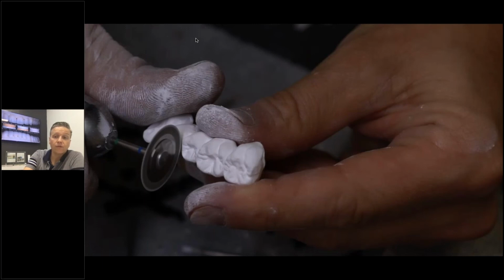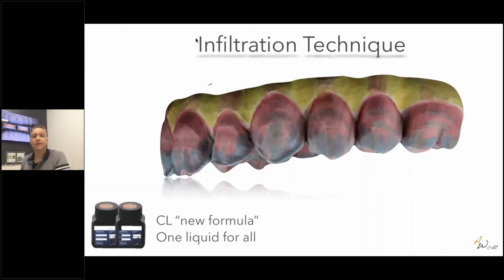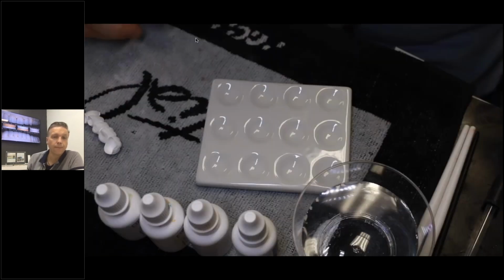And then we start with the infiltration technique. For the infiltration technique, I'm utilizing the Ceramic Liquids new formula. I basically utilize just the new formula. I don't utilize the FX liquids because for me that's a liquid for all. I can utilize that liquid for all my zirconia. Very nice, very easy. And I want to go to another video where we can show how to set them up with the marker colors.